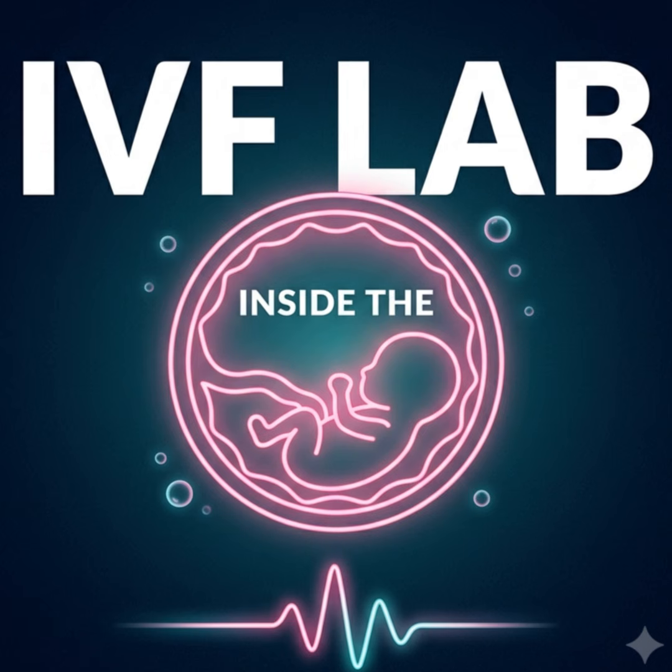That is so profoundly confusing for a listener and, frankly, incredibly frustrating for a patient trying to make a decision. You hear about this amazing technology. It intuitively makes so much sense. You know, we leave the oven door closed. We get thousands of images. We use supercomputers to avoid abnormal divisions. Why is it so incredibly hard to definitively, mathematically prove that this marvel of technology works better than an embryologist with a microscope? Because in scientific studies evaluating time-lapse, disentangling the variables is a monumental, almost impossible challenge.